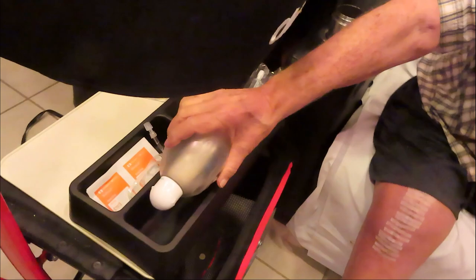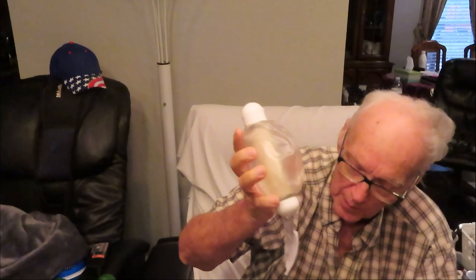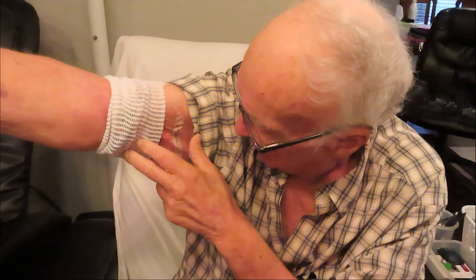Instead of the IV hanging on a stick like that, it's under pressure of some sort. You open it up. I have a PICC line that goes here, goes up my arm, around, and goes in my heart. You hook it up to clean it out, hook it up and everything. I have to have one of these every day for 6 weeks total.